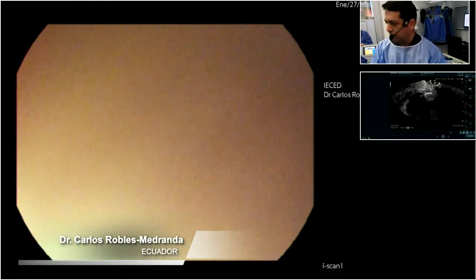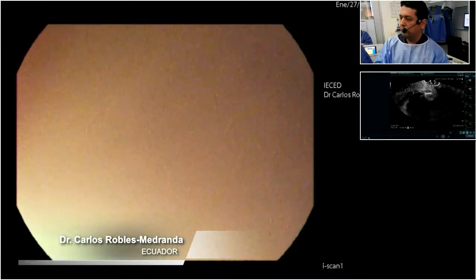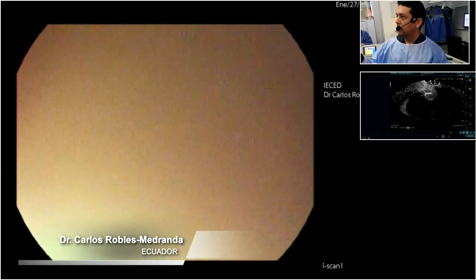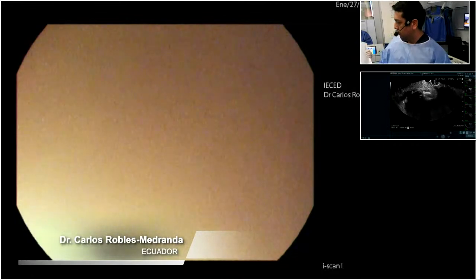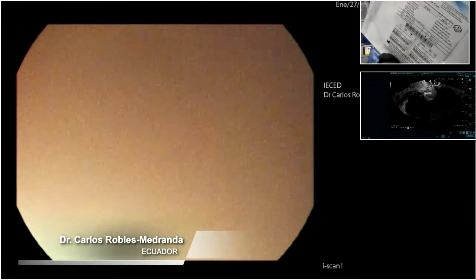That's correct. This is the length, you know. So it's a 50 millimeter. It's 12 to 15. It's okay for Microtech. Oh, it's a nice product. Very nice product.